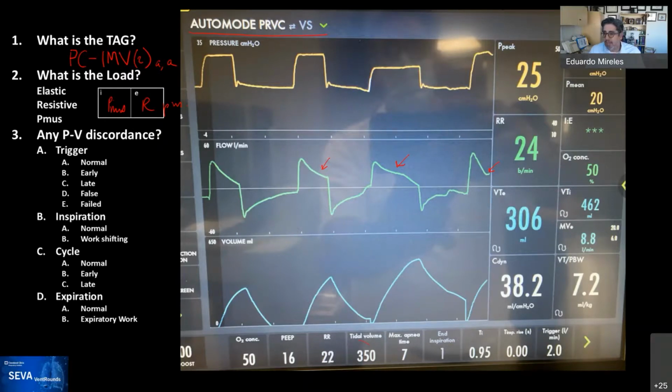And so I don't know if there's other overriding algorithm that is sabotaging this. I think what it is, it looks at the total cycle time breath by breath. Okay. So the total cycle time you can see between the second and the third is shorter than the total cycle time between the first and the second, right? Okay. So total cycle time is 1 over the frequency. So you could actually calculate a frequency on a breath by breath basis. So you're talking from here to here. Yes.